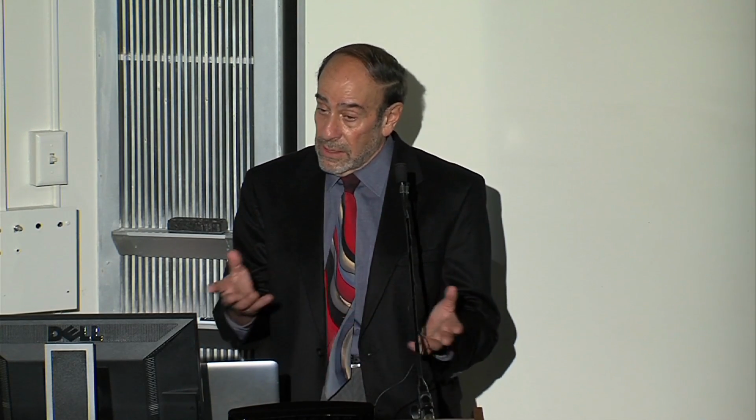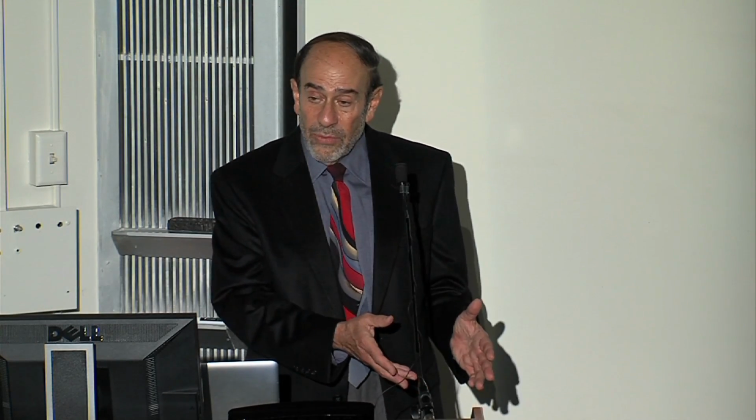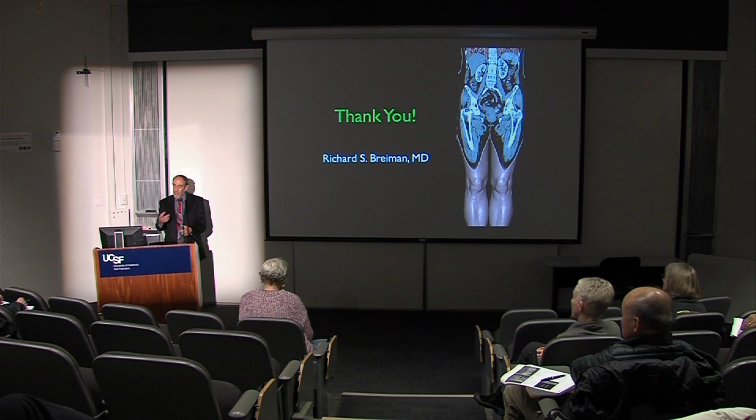You bring up a really important point. They're all different. They can all do about the same things. Some do it a little bit better in one way and have more computer-based tools. But because their user interfaces are different and they're complex, it's very hard to train a technologist to figure out how to use it. They get used to using one, and there might be another one that comes along that's even more powerful, but they don't want to use it because they don't understand it. They understand the one they're used to. Is that what you're talking about?